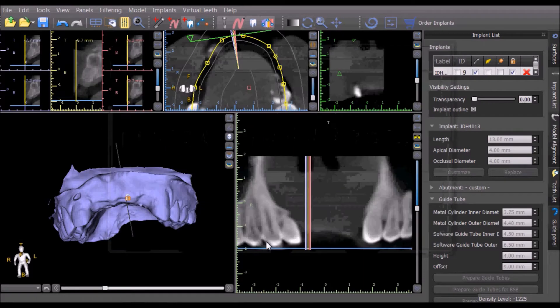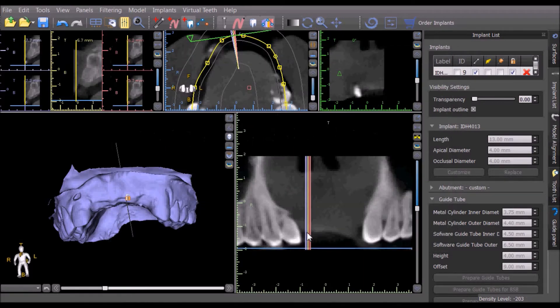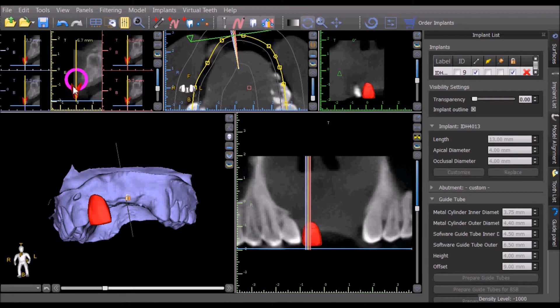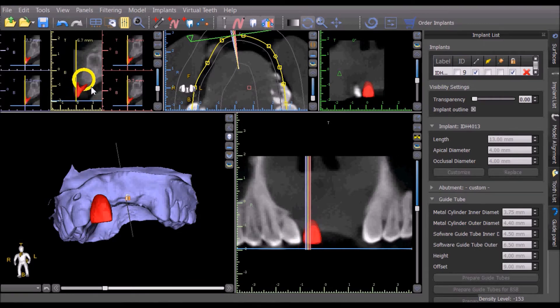Initial placement can be done by left clicking in any of the 2D views. The tooth alignment can be modified in any view, including the 2D and 3D views.